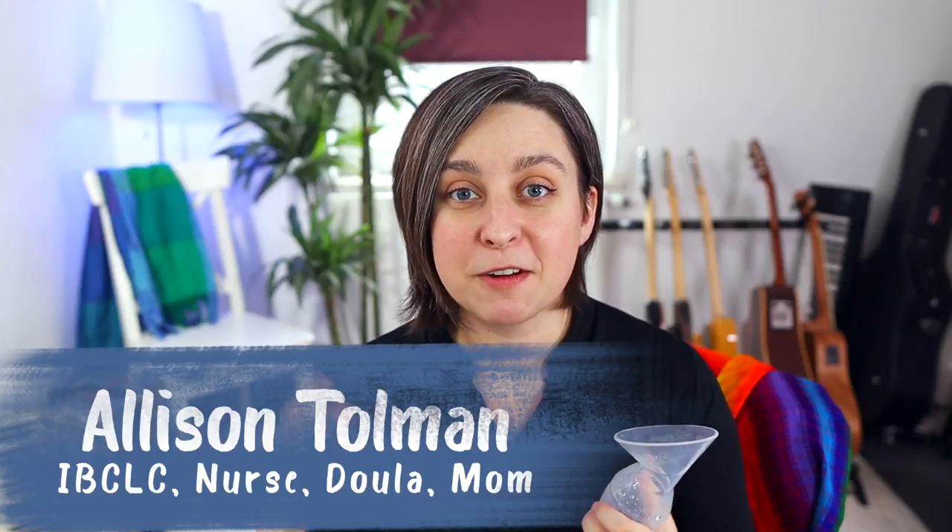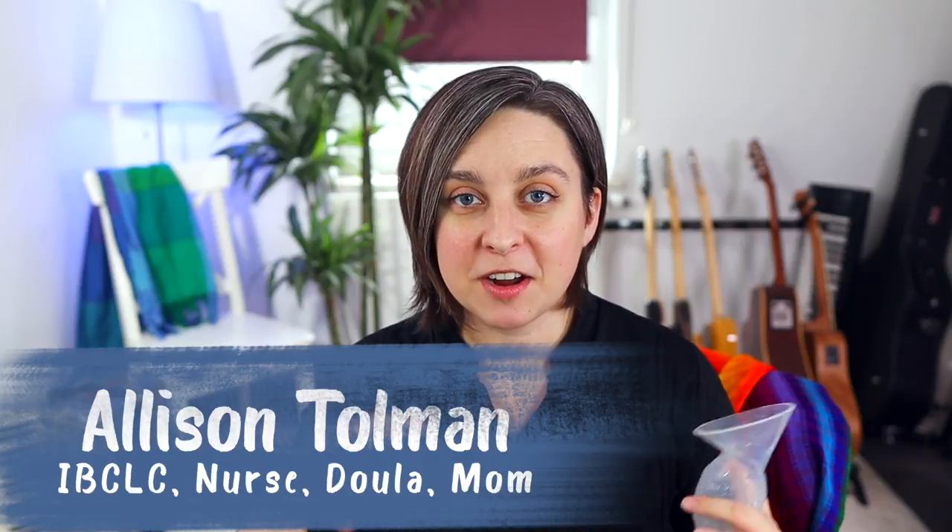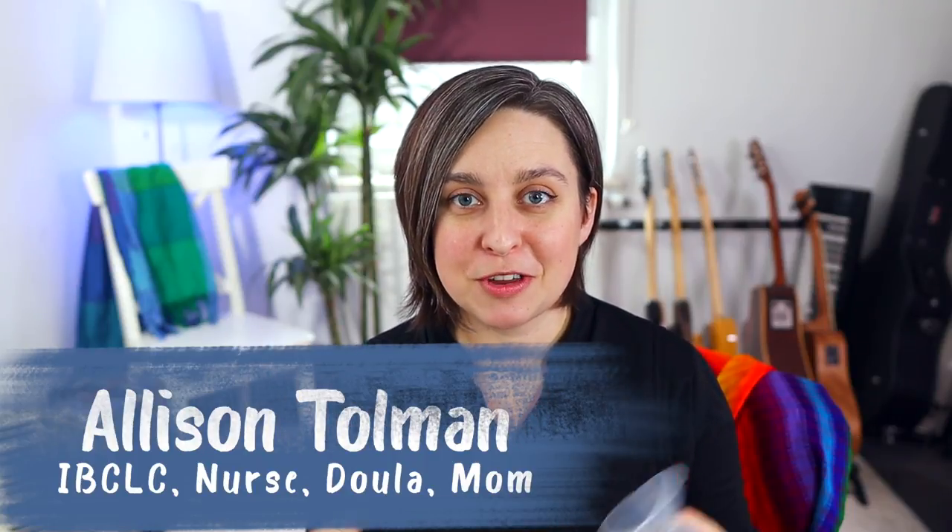Hey everybody, it's Allison here with New Little Life. I just saw my Haakaa pump on the shelf and I realized that I had four different kinds of Haakaa pumps. So today I'm going to show you each of those — pros and cons of each and kind of what they're for, so you know the difference. So I have the Haakaa, just the regular one, a milk catcher, a little Haakaa ladybug, and the Generation 3.